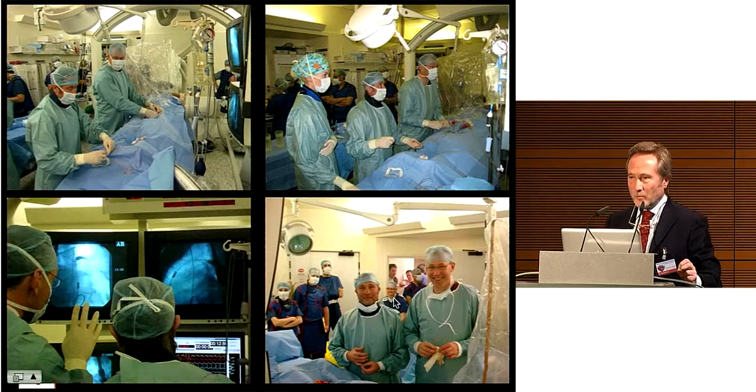And the program from Medtronic is underway to go ahead with this new device for treating patients with previous surgery with transannular patch, mainly with pure regurgitation, a very, very dilated main PA and right ventricular outflow tract.